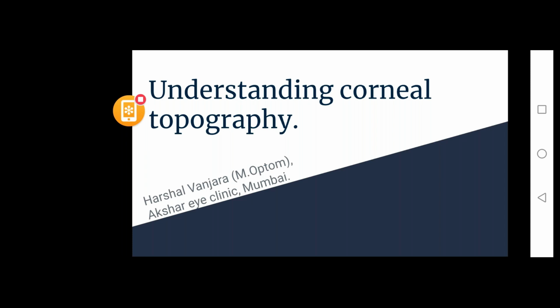So, there are a lot of loopholes amongst optometrists and even with some of the ophthalmologists. So we are here to breach those loopholes and try to understand how corneal topography works, and what those reports mean. What do those colors mean?